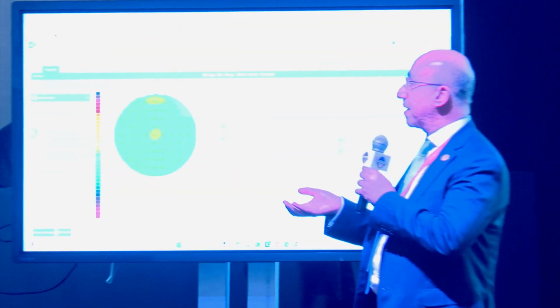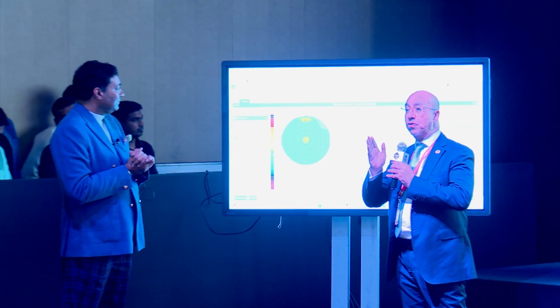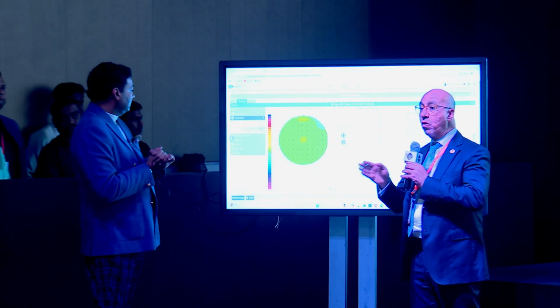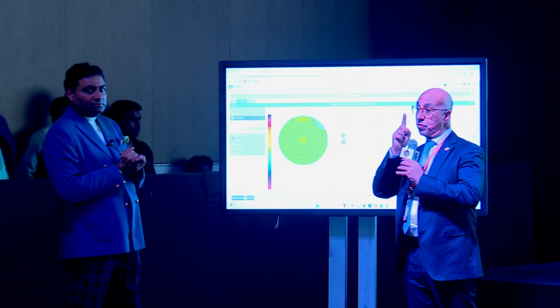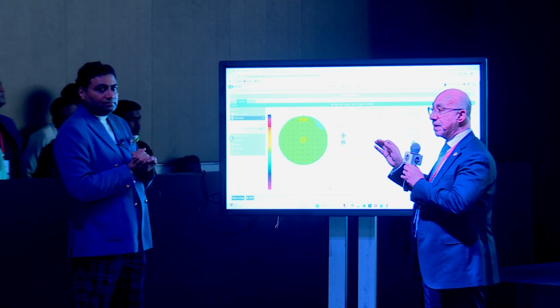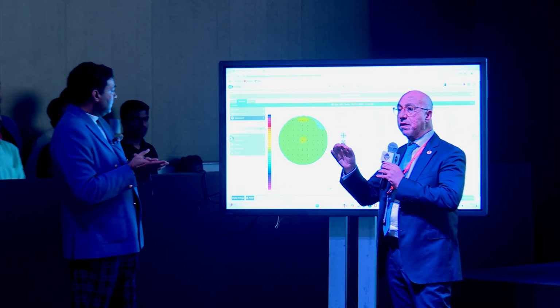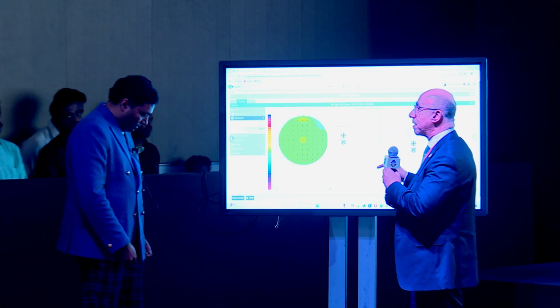I mean, the machine tells the patient, but you need to be a little intelligent. So with artificial intelligence, it asks the patient to fix in a line, and it takes one of the most accurate tomographies. It takes the whole thing in 1 second, and 1 second is enough for the patient to concentrate in the right position, and it repeats it again. When it is 0 repeatability, in the same position, same thing, same reading, it means an accurate repeatability, and it checks the repeatability in the anterior, posterior, and stromal surface.